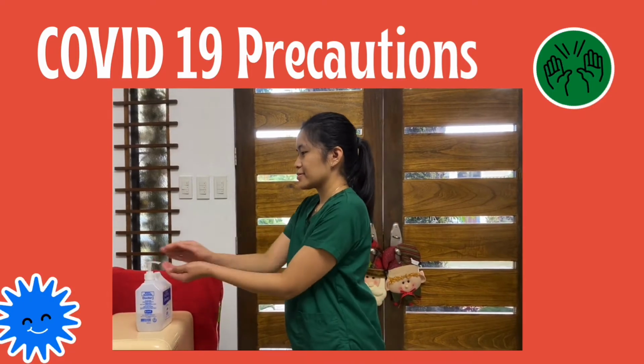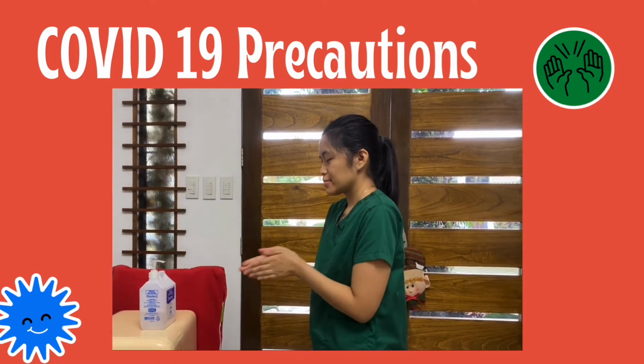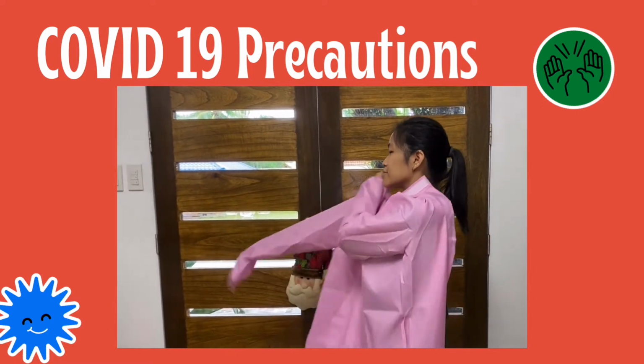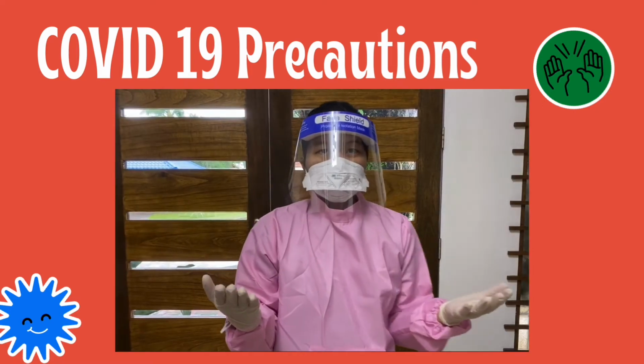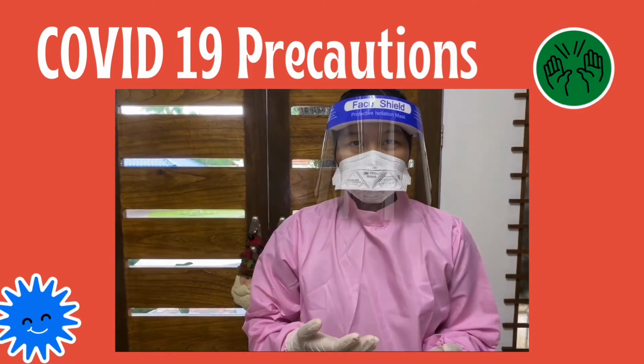Since the patient is positive for COVID-19, safety precautions should be practiced: disinfecting of the hands, wearing of PPEs, and limiting the personnel in the room. Aerosol boxes and video laryngoscopes are also recommended.